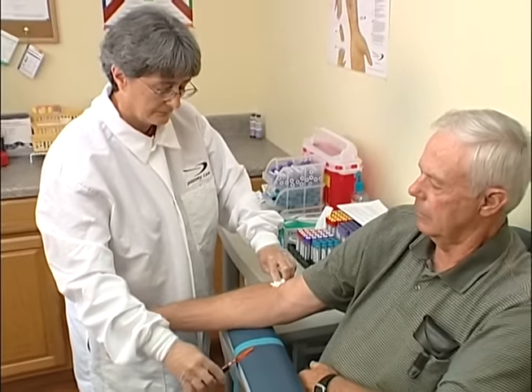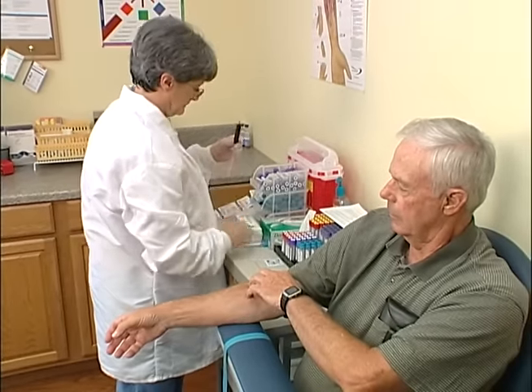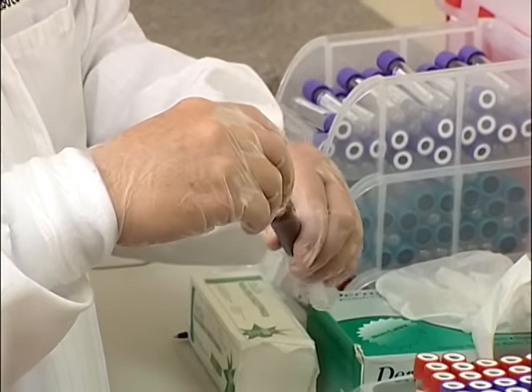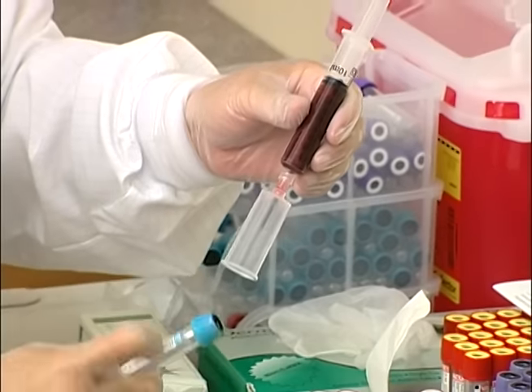Immediately activate the needle's safety feature and remove and discard the concealed sharp according to OSHA guidelines and your facility's policy. Apply a safety transfer device to the syringe and fill the tubes in the prescribed order of draw.